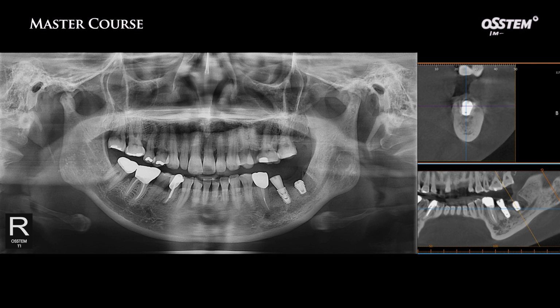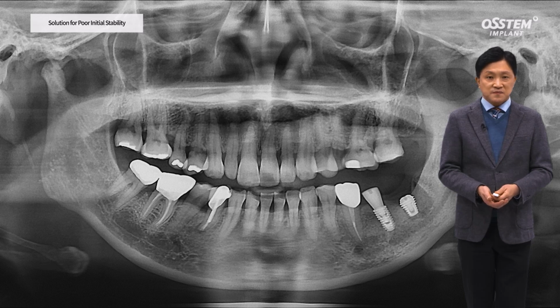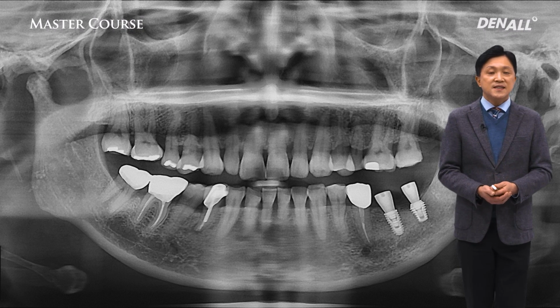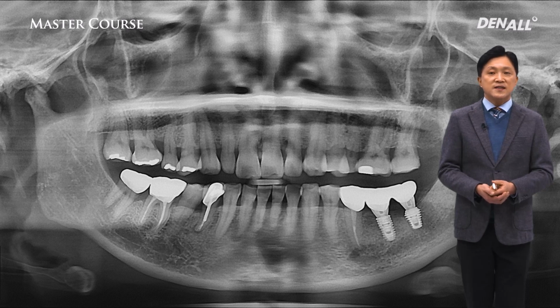Post-op panorama and number 37 CT. You can see the situation was like this, and the implant is like floating in there. Will bone attach to the implant, and will the implant integrate with bone over time? You can see the progress of ossification. Second surgery was done, and prosthesis was delivered before finishing the case.